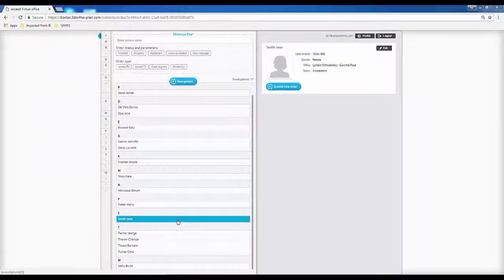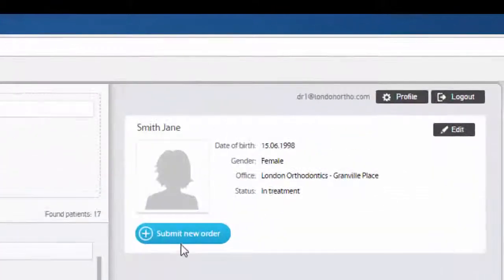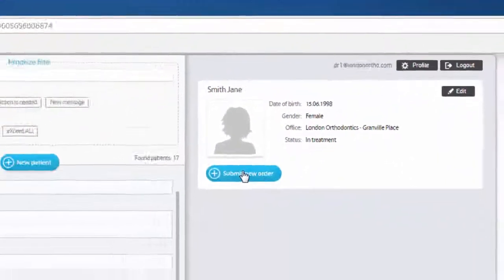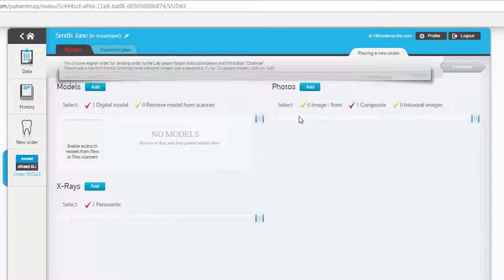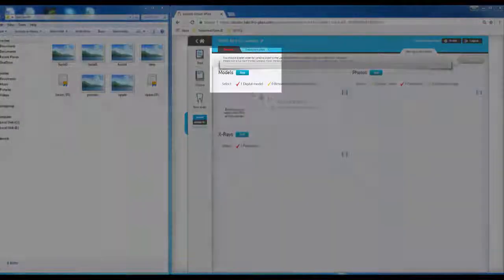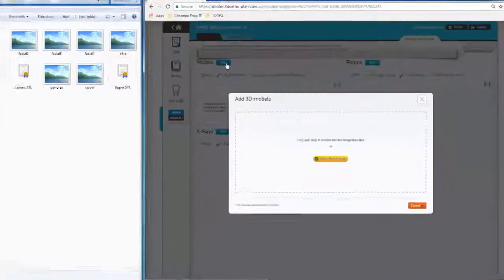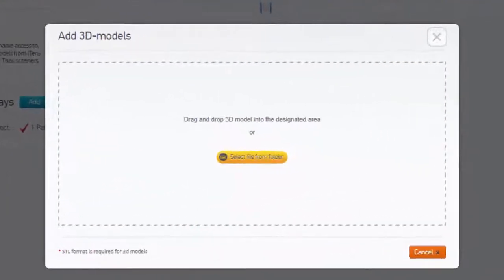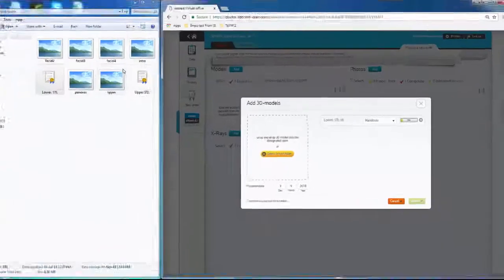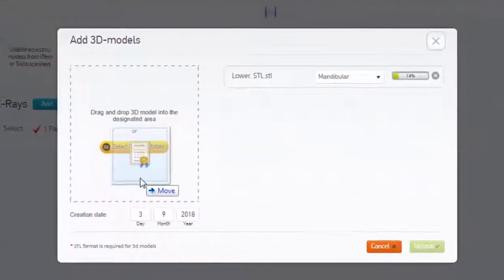After selecting the New Order command, the Records area is where the patient's diagnostic records are to be added. Start with the models. Drag and drop or simply select the upper and lower STL files to be uploaded.